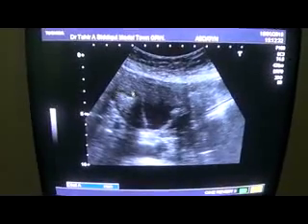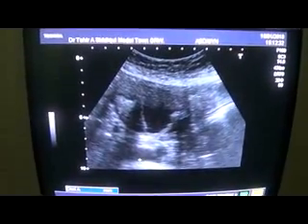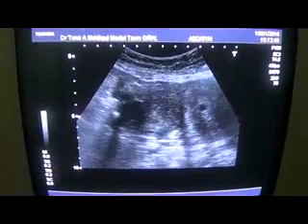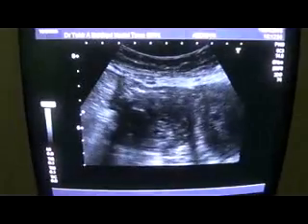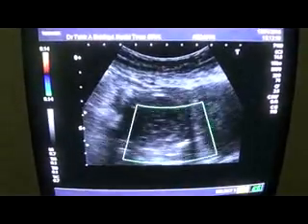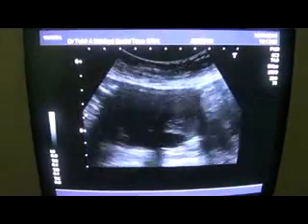This is the echogenic area. This is the septa. This is a thick septa. These are all septas. You can see the movement of the debris. If you concentrate on this area, we see a bit of movement in this region, and it shows vascularity as well.